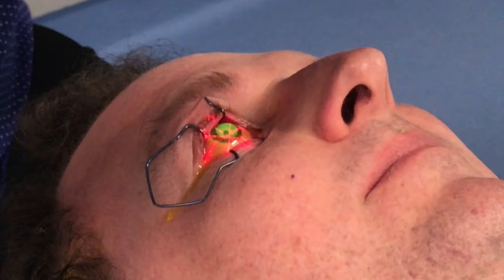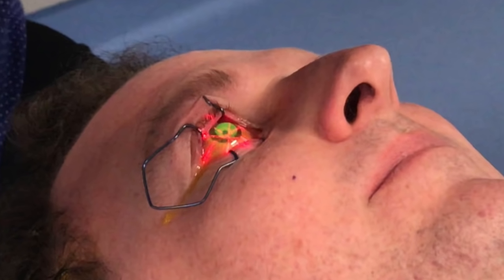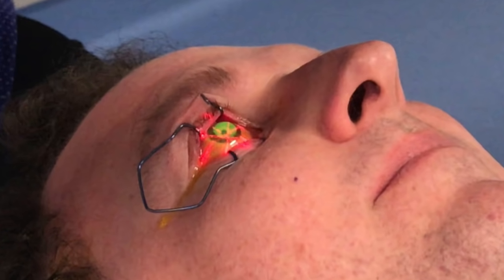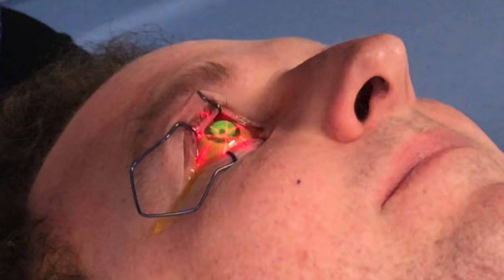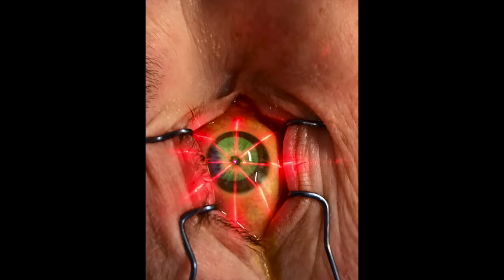Once the cornea has an adequate penetration of riboflavin into the stroma, the crosslinking machine is placed over the patient's eye for a period of up to 30 minutes. The patient simply looks up into the machine to see a series of LED lights. It's not unpleasant — it's a little bit boring, but there'll be music playing in the background. The combination of the riboflavin and the UV light makes the cornea fluoresce quite a bright yellow colour that can be easily seen by the other people in the room.